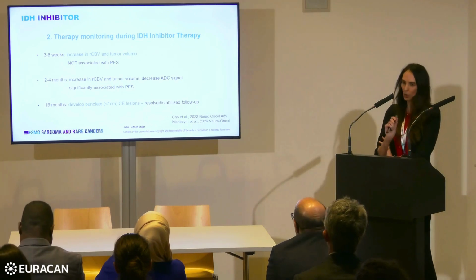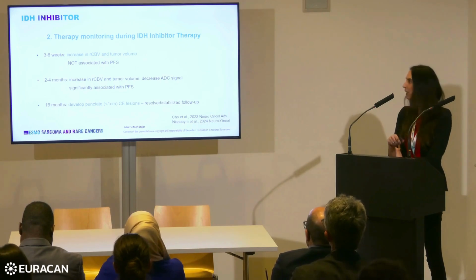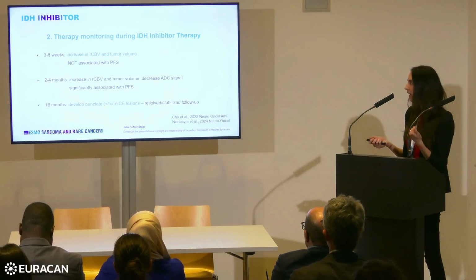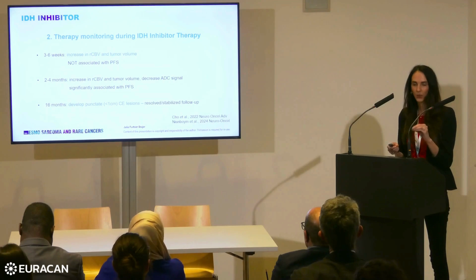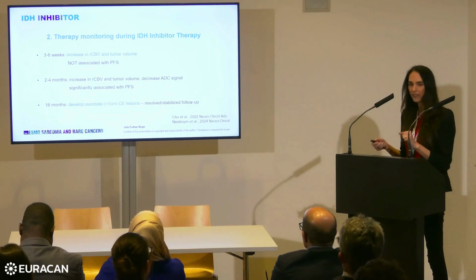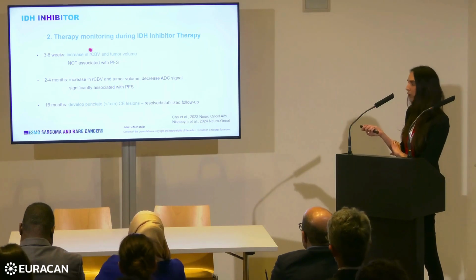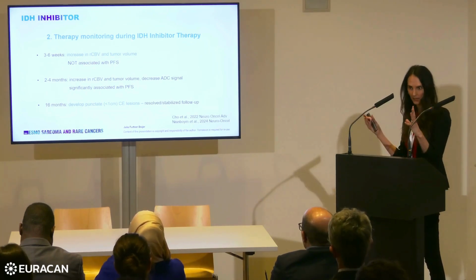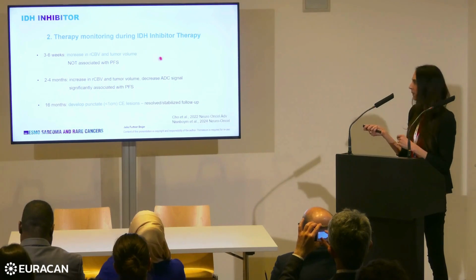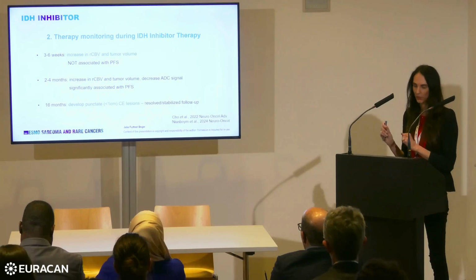Now, what should we be aware of when it comes to therapy monitoring during IDH inhibitor treatment? There are 2 things. The first is, if you start treatment and you do a follow-up examination very early, so 3 to 6 weeks after therapy initiation, there may be an increase in perfusion and in tumor volume size. Please do another follow-up examination, because this does not necessarily be associated with progression-free survival.